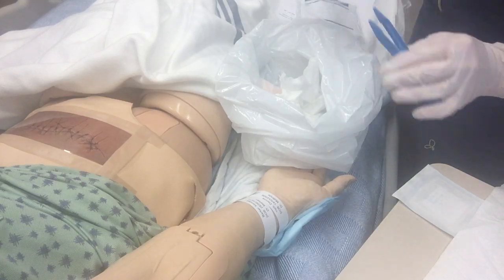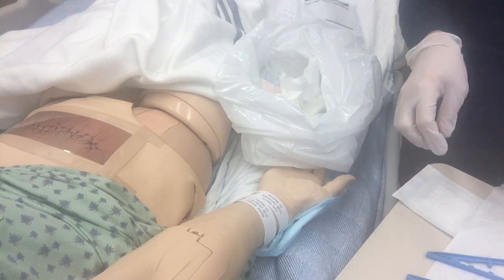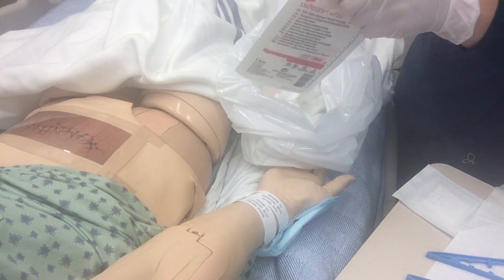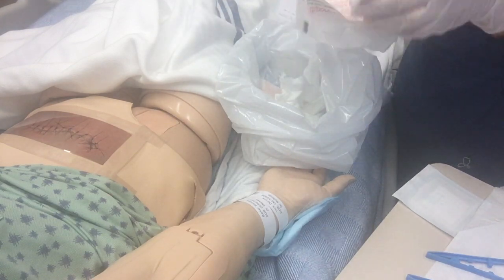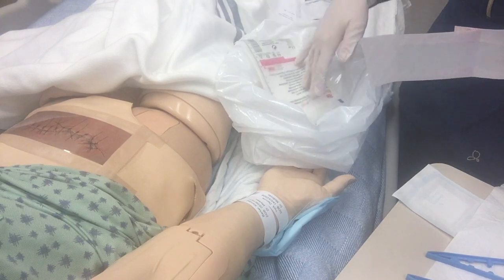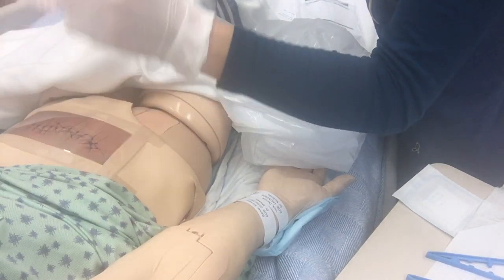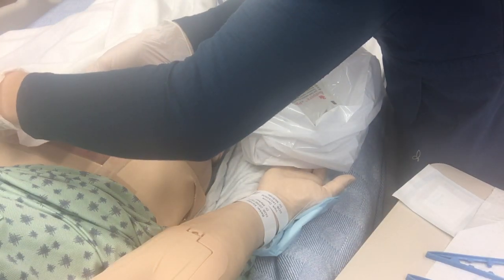Once I'm happy with it cleaned, dried, and my assessment of the wound, I'm then going to, using sterile technique, open up my new dressing. Okay, so the top of this dressing is open to the air, so that is not sterile, so I can touch that. I'm going to garbage that. But now the bottom is, so I want to take this flap and I'm going to put it, making sure I measure it, that it's going to cover all of it, okay? And I'm going to lay this down.